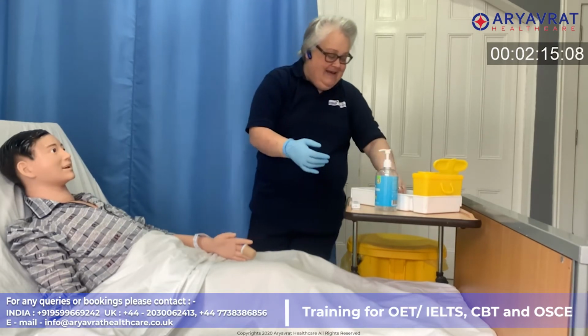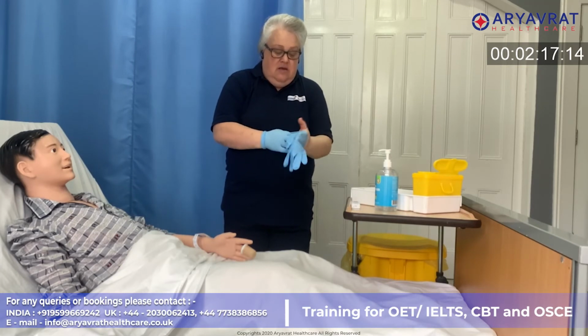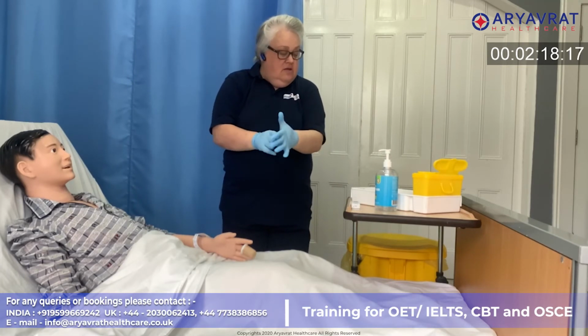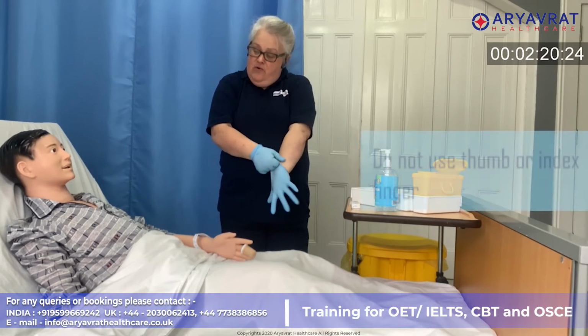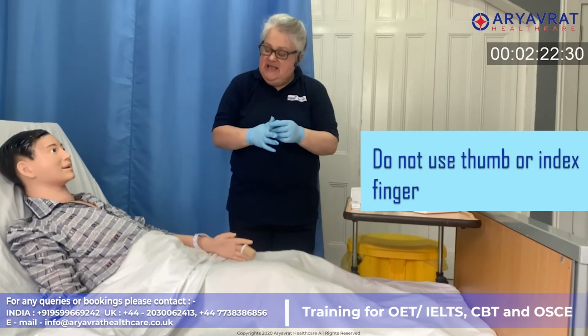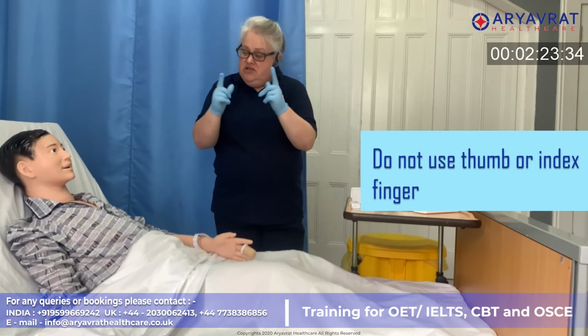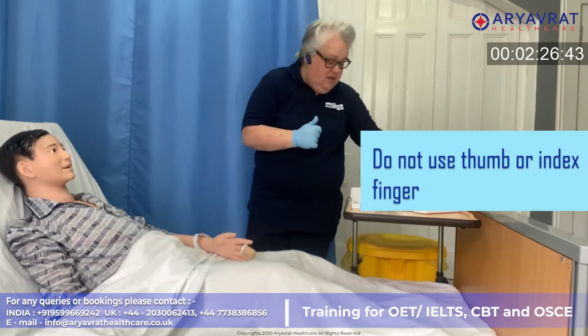Sure. Okay, so I'm popping on a pair of gloves before I start. So I'm sure you've found by now that if you do your thumb or your index finger, because we use those fingers the most, it tends to get sore. So we advise not to use your thumb or your index finger, but we would use the two middle fingers predominantly, okay? Okay.